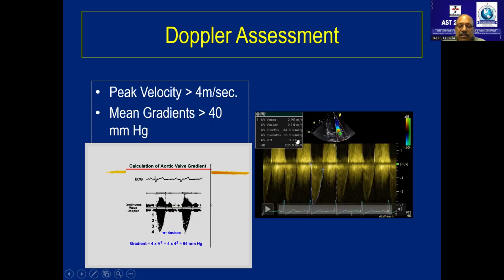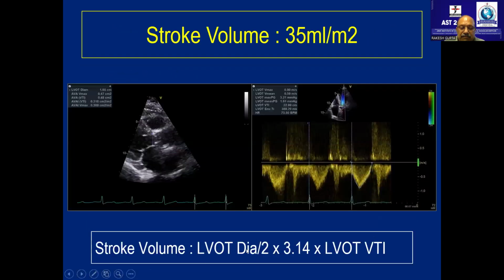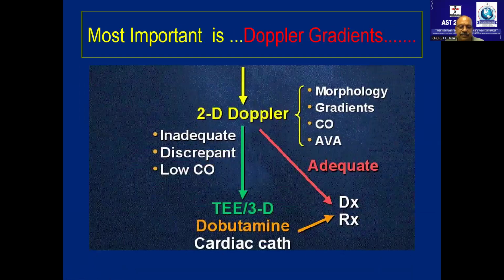And this aortic valve velocity VTI, if I go back to my previous slide, whatever the blood which is going through LVOT has to cross aortic valve, correct? So at LVOT, we have got a VTI and LVOT area. In aortic valve, we have got a VTI, but we do not have an aortic valve area. So what do we do? We divide these volumes by VTI so that we get an aortic valve area. I'll come back to it again.